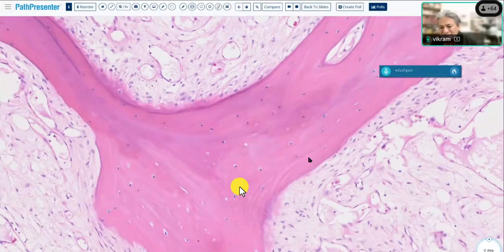And the reason I say that is, one, there's a lot more osteocyte nuclei. So this is the kind of cellularity. This is more mature bone where you can see beautiful lamellae. If you look here, you see some lamellae, but they're not very well organized. And it's as if this has been growing in different layers. So this layer looks different from this layer. So this is newer bone, which is why it's a little more cellular.